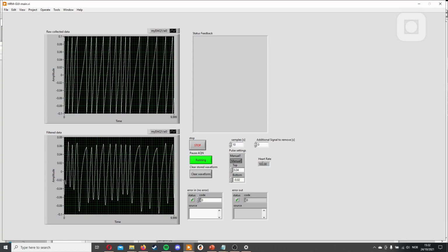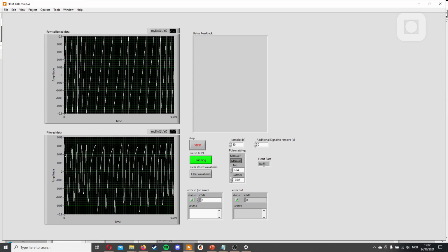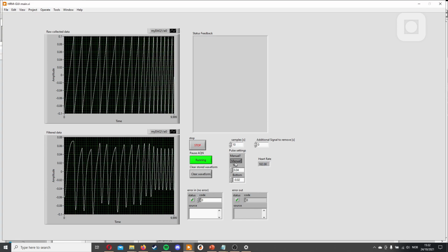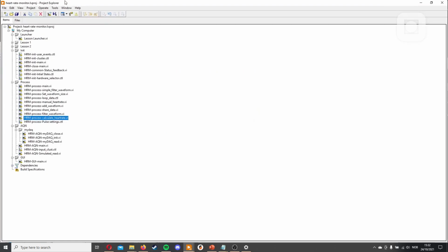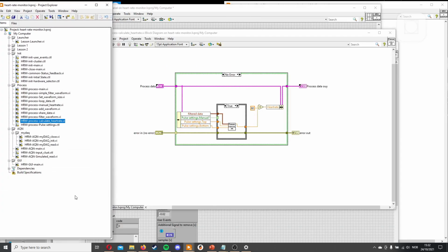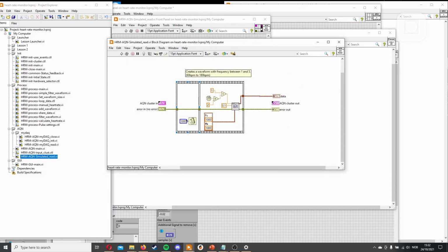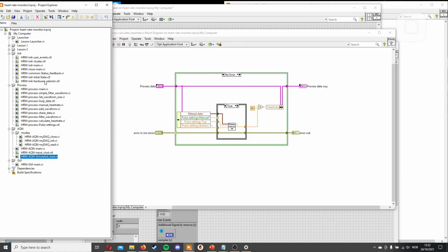You can see we get a little bit different data. It's hard to know with our random waveform generator. So what we could do to test it better is to go into our simulator and just cancel this one here, so we always get 60 hertz. Let's launch it up again.